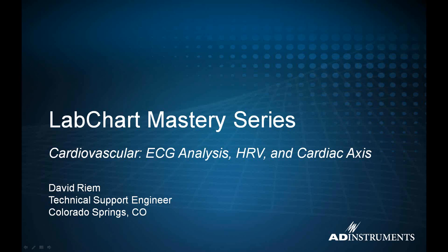Today we're going to discuss cardiovascular analysis, using our ECG Analysis module, our HRV module, and the Cardiac Axis extension.